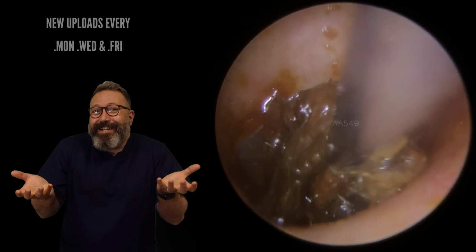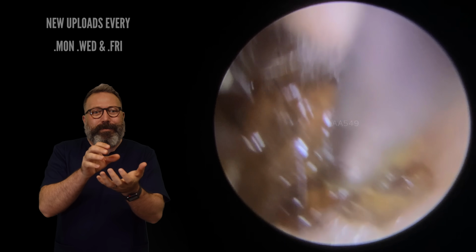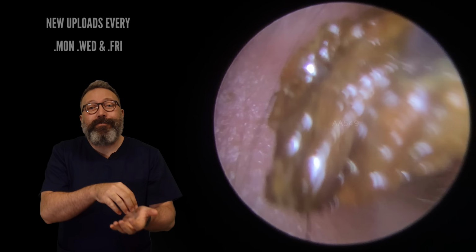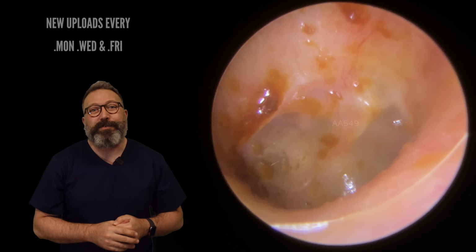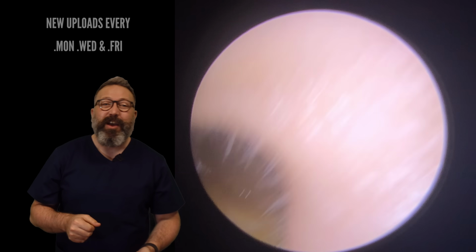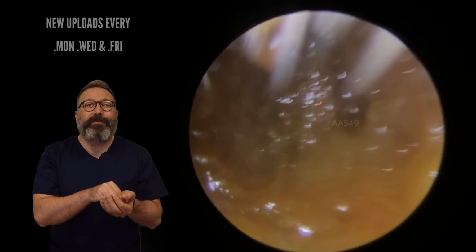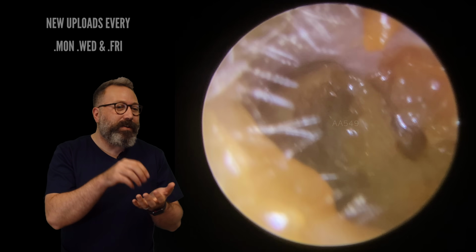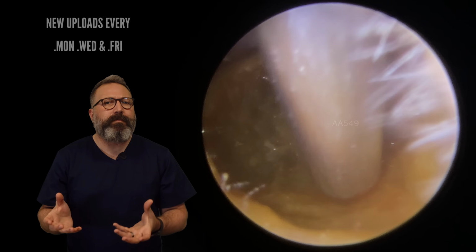Where was that hiding? Basically, you could just see the top of it. When that came away, I was like, oh my God, there's a lot. But there was so much left down in there, and that would have been so easily missed. You can see the eardrum looking so much better. We got a little bit on the left-hand side, but that's going to come away with the patient's next appointment. But you can see how it's so easily missed. And sometimes we get patients coming through who've had suction or some form of earwax removal, and they've not really been feeling much of the benefit.